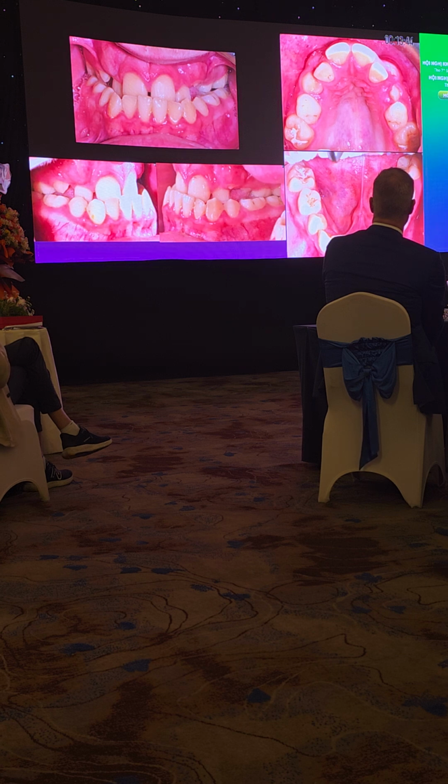Number two is your width is not done yet, right? The width, you don't know how much space. Because every millimeter you expand, you can get 0.7 millimeter of space, okay? But you have to expand a lot because he's got 8 millimeters deficient just on one side, all right?